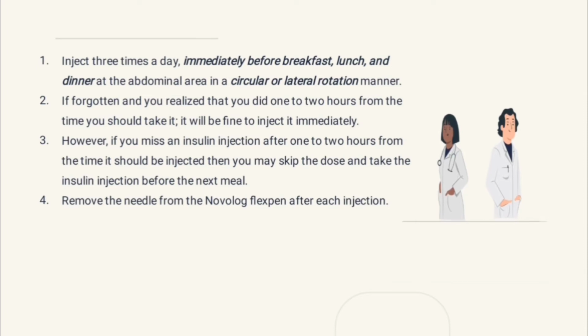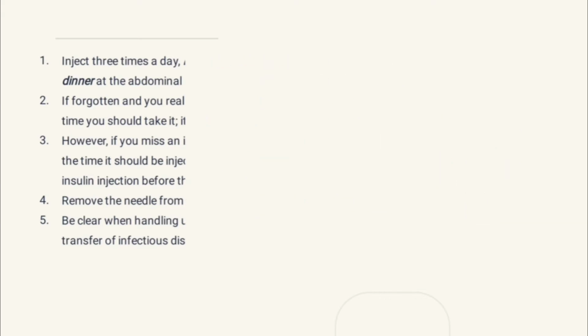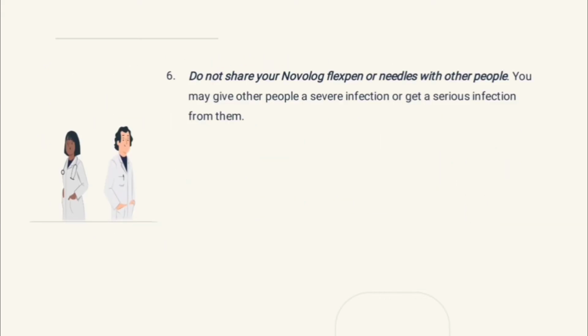Remove the needle from the Flexpen after each injection. You cannot reuse a needle. Be careful when handling used needles to avoid needle sticks and transfer of infectious diseases. Do not share your Novolog, Flexpen, or needles with other people. You may give other people a severe infection or get a serious infection from them.